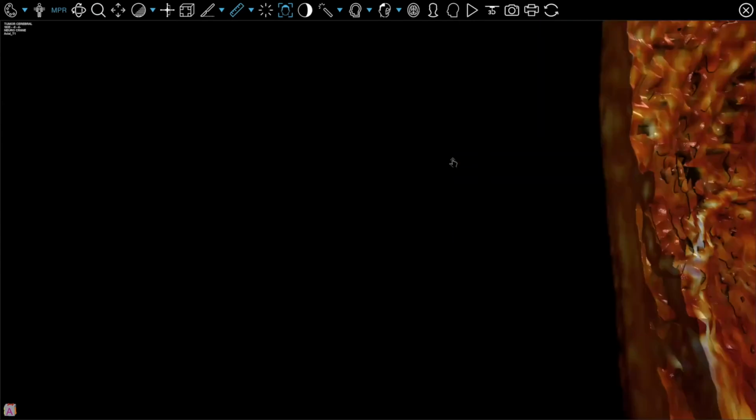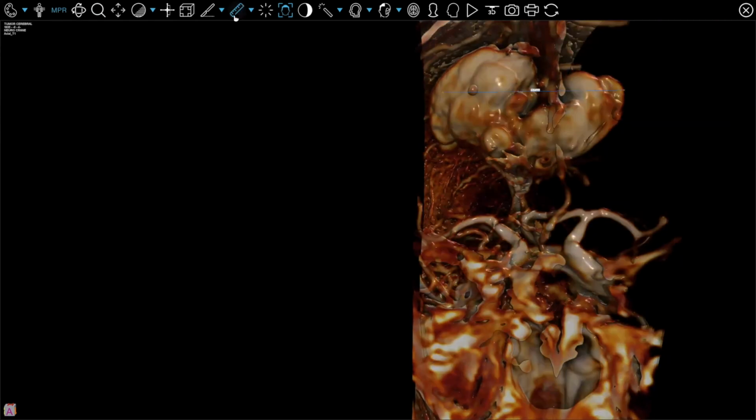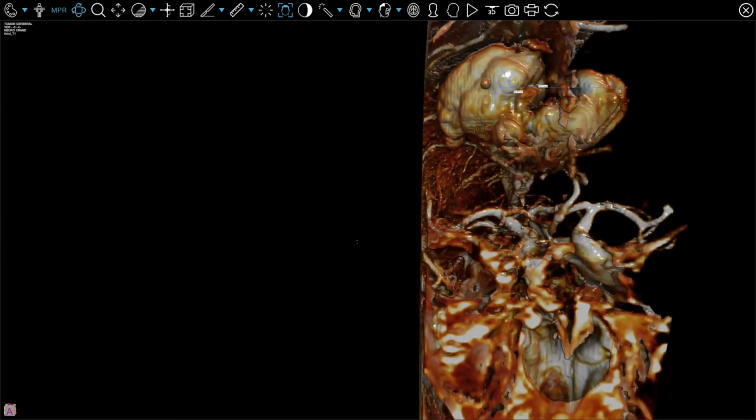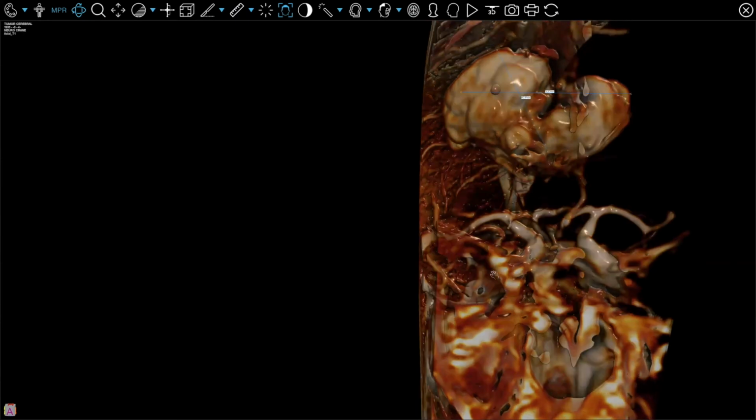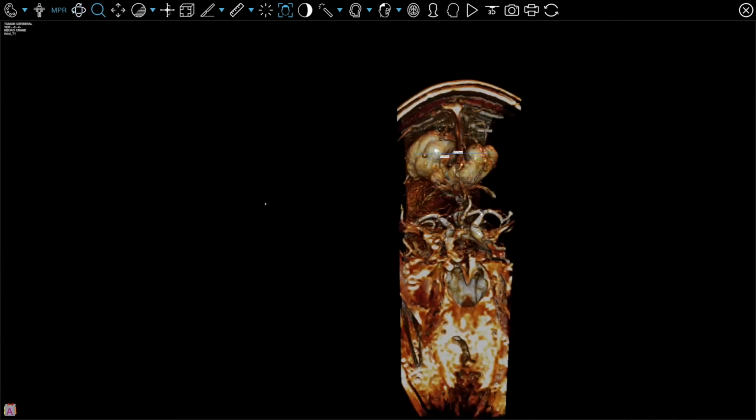This is really interesting, guys. This is the 3D reconstruction our system did, and it's very accurate in terms of measuring the size of the tumor. So using this kind of software, you can plan for procedures, you can plan for incisions, you can see what is the best way to access this tumor, in a very practical way.